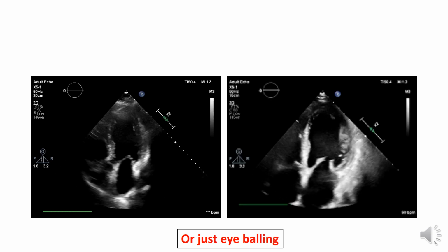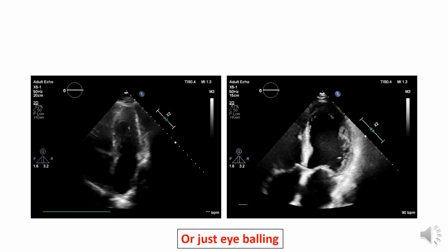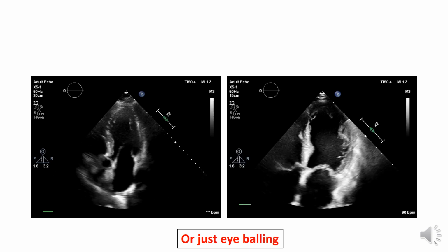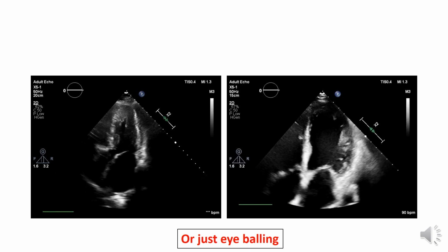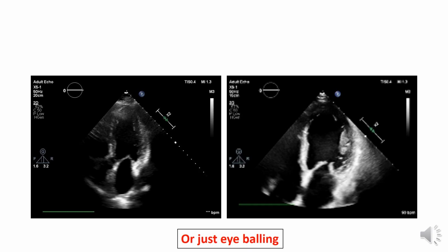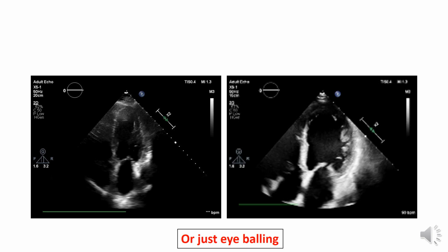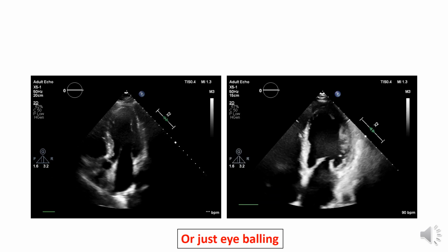Here is good LV systolic function, whilst the previous patient also has the ventricle almost standstill as we said. So just by eyeball, if you have this scenario, mostly this is not cardiogenic shock. It might be distributive shock, septic shock, or something like that. If you see this ventricle, most probably it is low cardiac output, with an element in this shock.